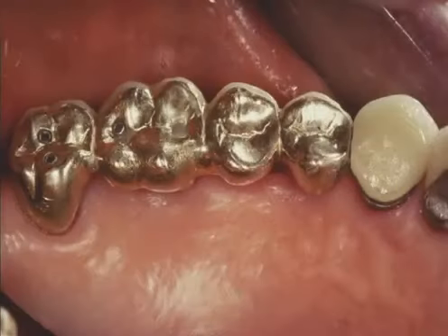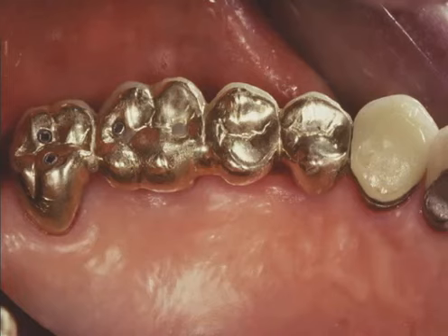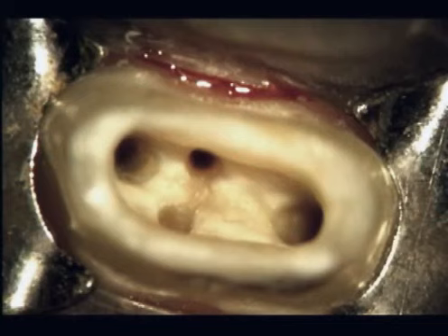When considering endodontic retreatment, clinicians frequently encounter a variety of different restoratives such as crowns, bridges, or long-span splints. Regardless of whether we access through, sacrifice, or remove a restorative, we need straight-line access, divergent axial walls, and an access preparation where the orifices are just within this outline form.